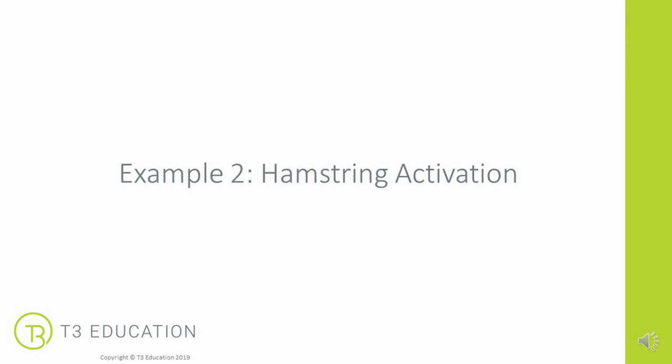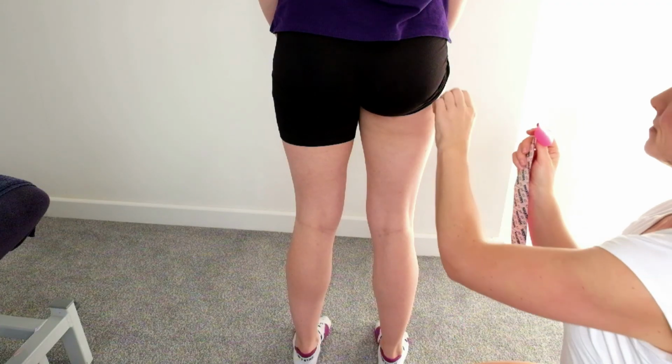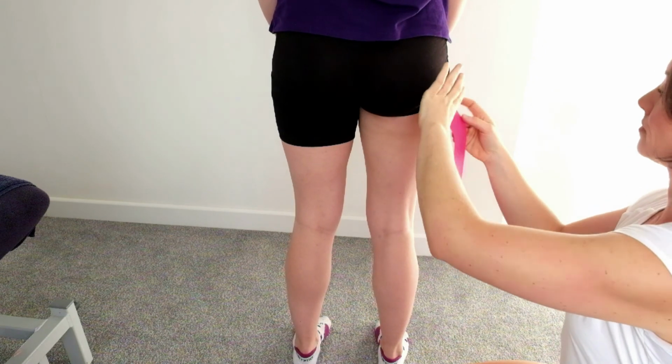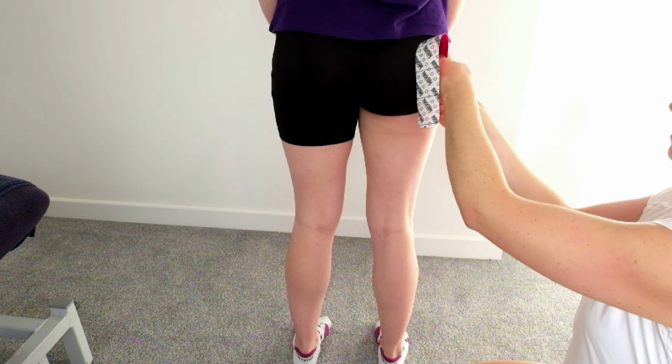Our second example here is looking at the hamstring, so a lower body activation. And you will see that the process is the exact same, we're just working on larger muscle groups and bigger joints. Here I'm going to anchor the tape at the hip, so it's lateral hamstrings I'm working on here. So no tension on the tape, no stretch on the tissue.